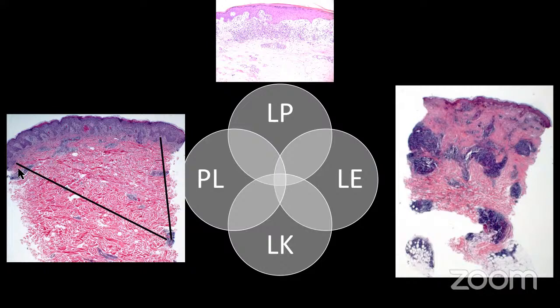But with involvement of the superficial vascular plexus, postcapillary venules, and then also the other smaller vessels as they start at the bottom of the dermis. And then lupus tends to be classically more bulky around the adnexal structures, so it won't be quite so wedge-shaped, even though it's around the vessels. It'll be heavy in certain areas that happen to correspond to eccrine coils.